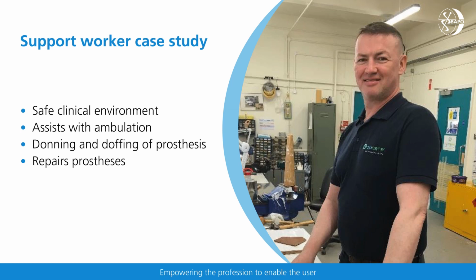He discusses directly with the patient the issues they are having with their limb and carries out necessary repairs while the patient waits. Should the patient communicate that they are having a socket fit or alignment issue, Johnny will liaise with the prosthetist to arrange a prosthetic review appointment. If he becomes aware they have a skin problem or wound, he can suggest they are seen by the doctor.